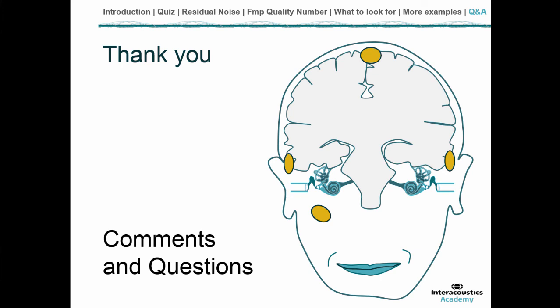Again, if we look at the UK guidelines and the experience they are building up, we know that having the FMP and also having the residual noise is really appreciated by the market, and they kind of advise people to use it if they have it available.